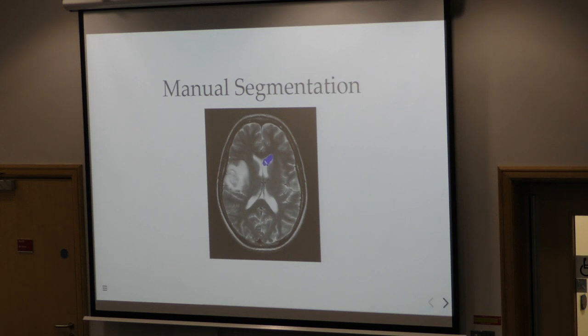I would just have to manually fill in that like this, and you can imagine going through this process on what is potentially a stack of hundreds to thousands of images very quickly becomes very tedious, very easy to make a mistake, very easy to lose focus, and ultimately not very efficient in terms of speed. So based on those previous criteria, it's not very fast, and it's not necessarily that reproducible, because individual people may differ in their interpretation of an image, even if they're both very experienced in a given area.